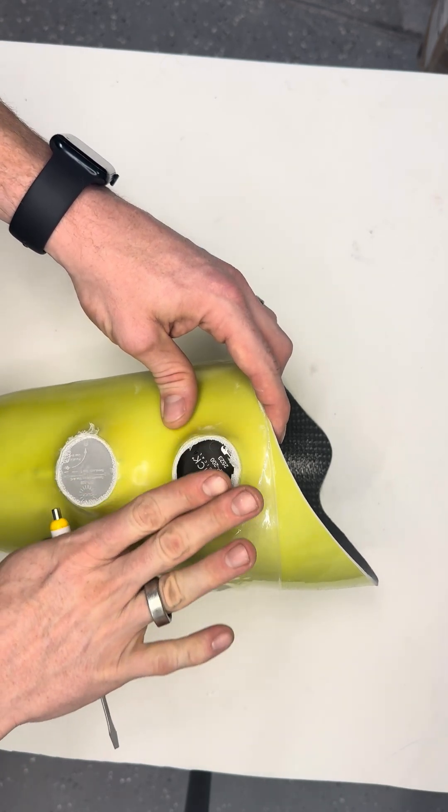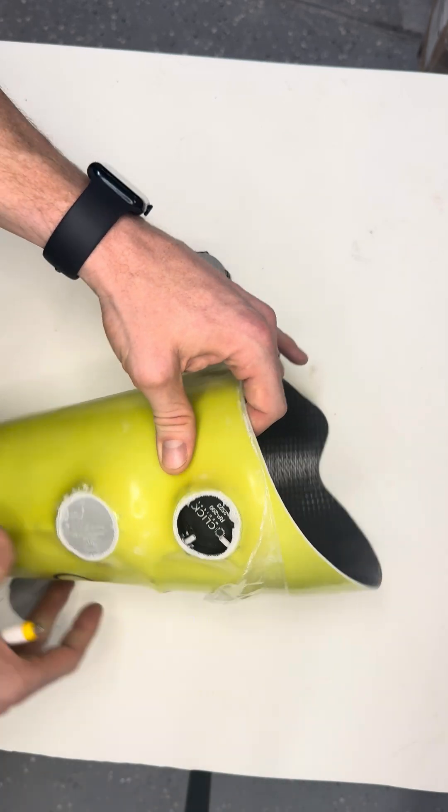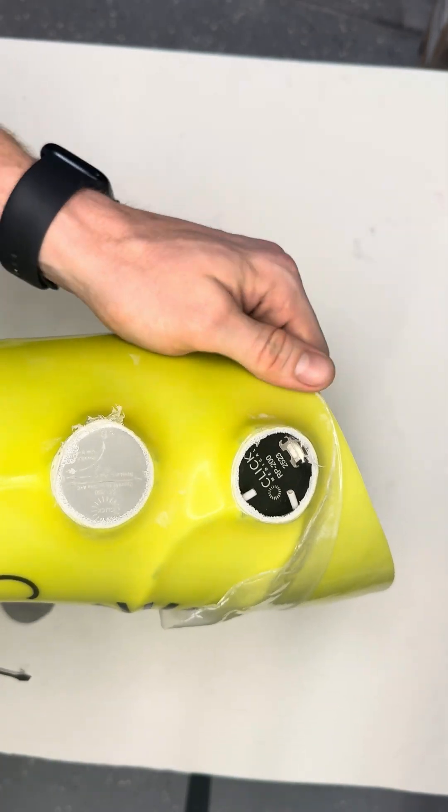If you were just to grind this element flat, it's going to be very difficult to actually see that retention tab location if you ever need to remove that Click Reel.